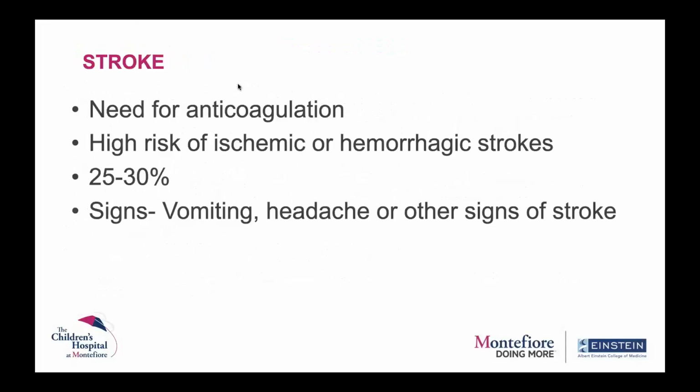I think I skipped over one slide. I'm so sorry. So here, one of the most important risks or complications of VAD in pediatrics that we worry about is stroke. If you have a clot on the left side of the heart, it can go to your brain and cause a stroke.